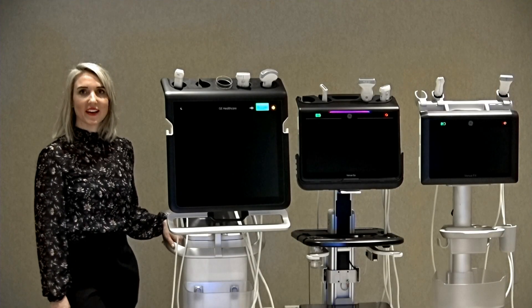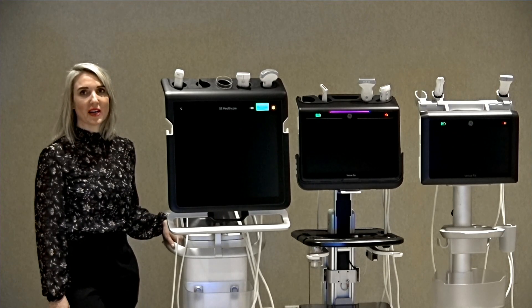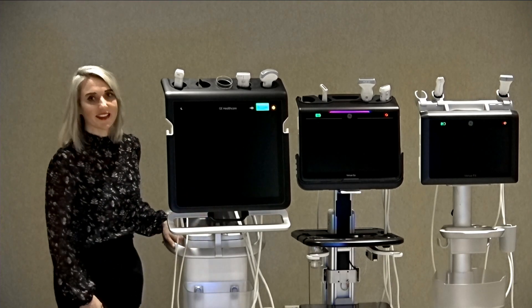Hi, I'm Beth, Point of Care Clinical Application Specialist for GE Healthcare. I'm excited to introduce to you the Venue family of products for Point of Care: the Venue, Venue Go, and Venue Fit.